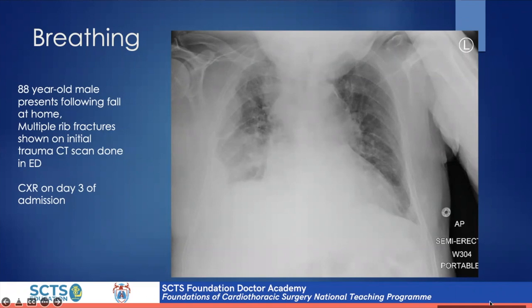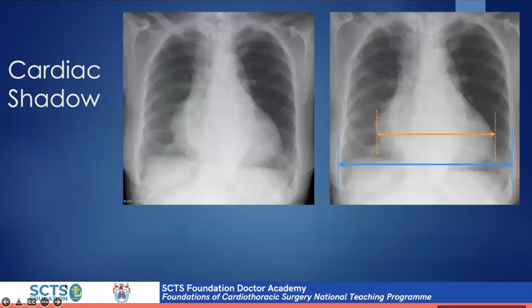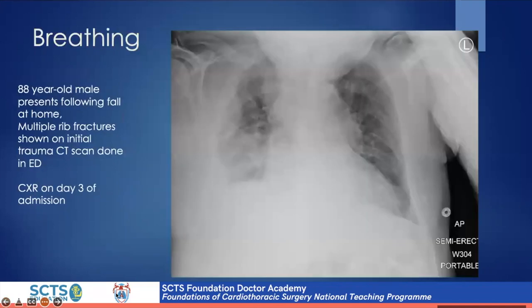Anybody? Well, I mean, the x-ray doesn't look great quality. We don't know if it's AP or PA, but airway-wise looks fine. I think it's an AP portable chest x-ray there. Sorry, the caption's just covering it. Oh, we're in the next one. Sorry, 1 second. There we are. Well, there is what looks like consolidation on the right lung base. You can't see the costophrenic angle really. Heart might be enlarged, but you can't comment on that on an AP.